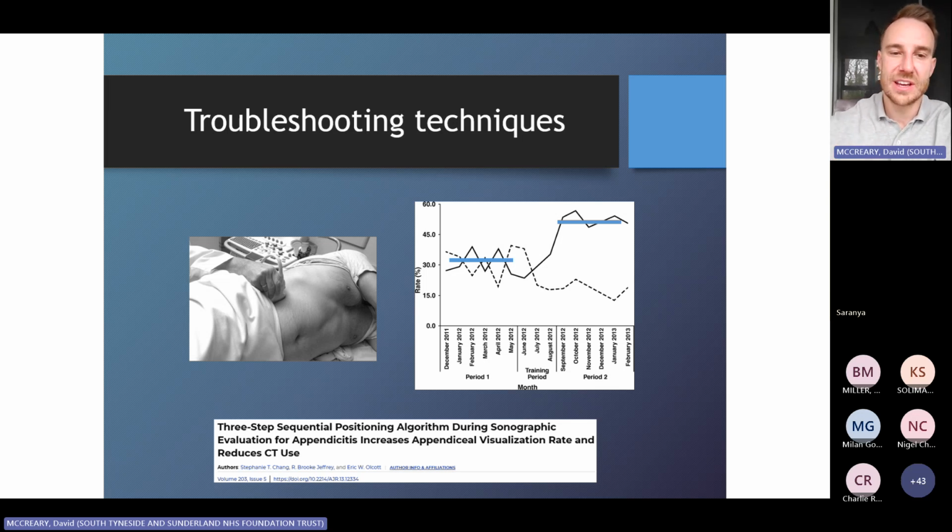But what I'd say again is, at a research level, of course, it's important to have gold standards for rule in and rule out and certainty. But in our pediatric emergency department, that's not as much what we're interested in. We're taking a condition with a known general prevalence. Not every abdominal pain is appendicitis, of course. That would be a very busy department if it was. And then we're looking at the pretest probability based on their clinical presentation and their findings. We're looking at the pediatric appendicitis score, and then we're scanning them if we've got the expertise, and we are making the decision about that. So in other words, I'm not that worried if I don't find a normal appendix.